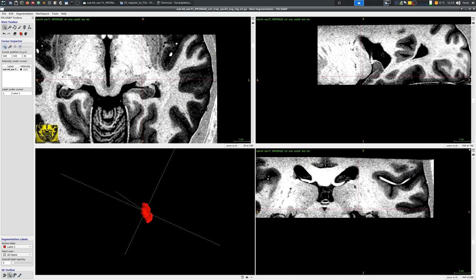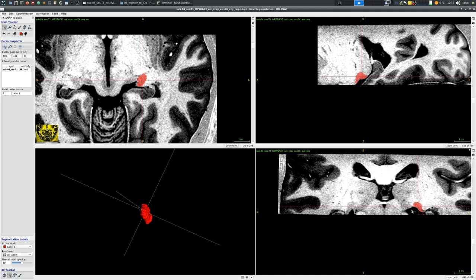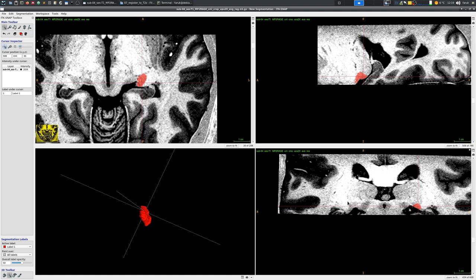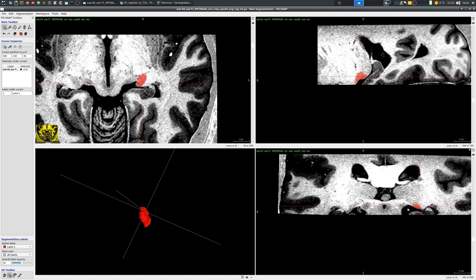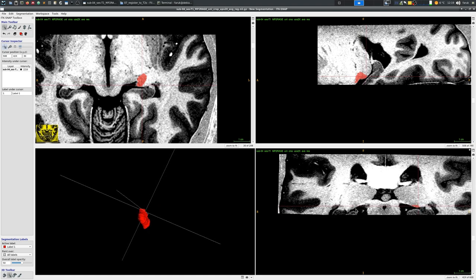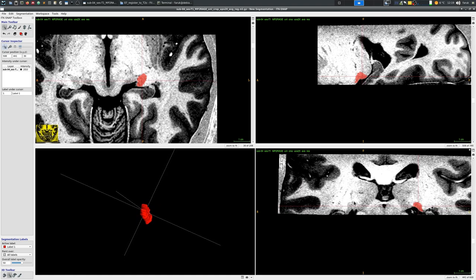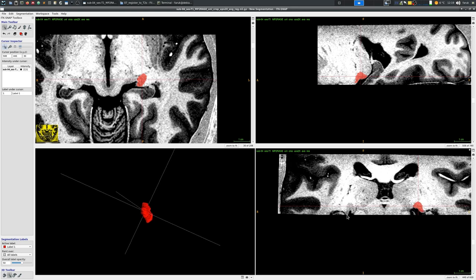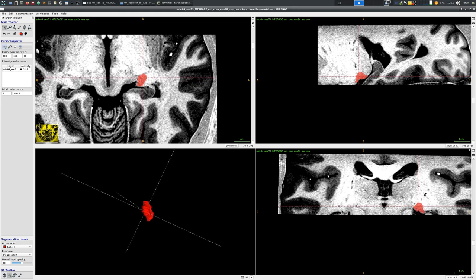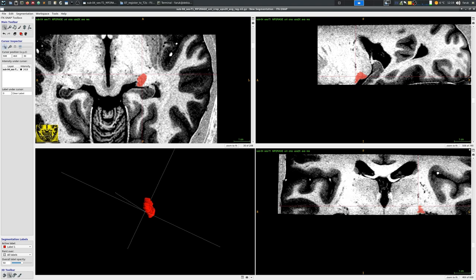One handy thing to check is to have a look at the other hemisphere and the symmetric counterpart of the structure. For instance here with LGN you can get a better feeling of if the area that you're covering is the right one by checking the symmetry between different sides of the brain.